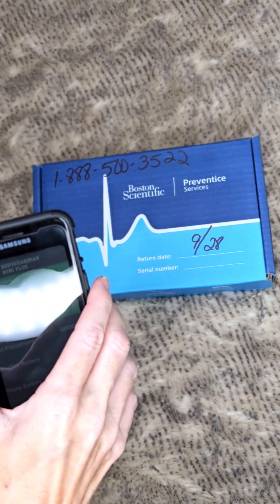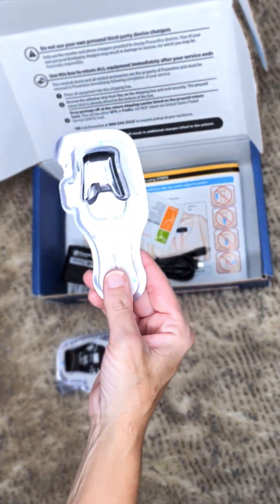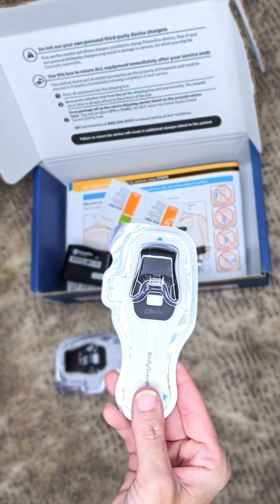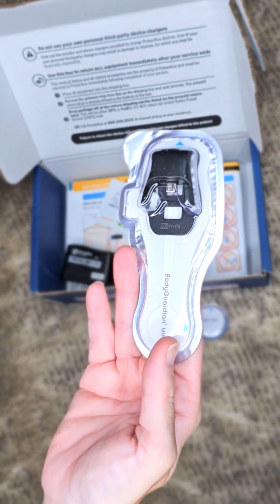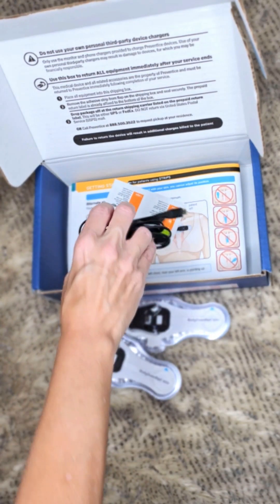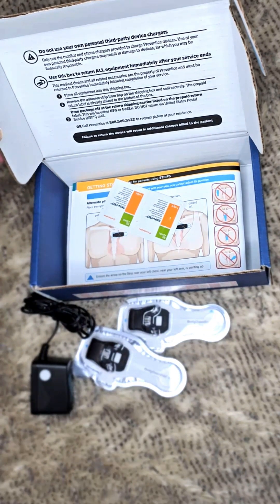As far as what's in the box: you get two extra stickers to place it in case it falls off. You also have to change it at day seven and charge it — the little piece that clips onto your body. They give you an extra one in case one falls off while working out or swimming. You can swim with this up to three feet, which is cool. There is a charger for both the phone and the sensor that clips into the monitor. On day seven, charge it for three hours, put a new sticker on, plug it all back in, and you're good to go.